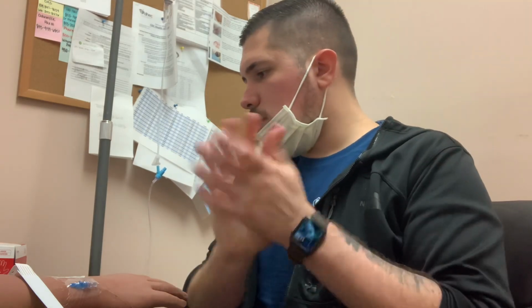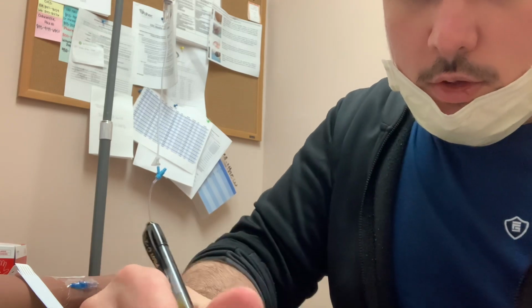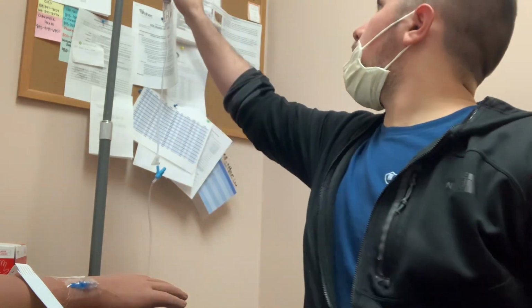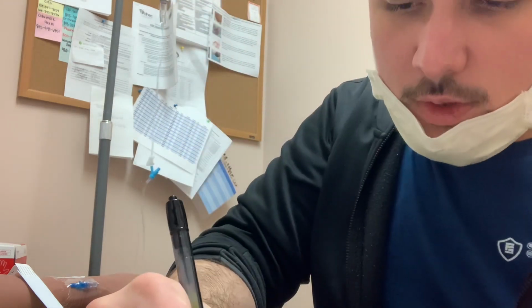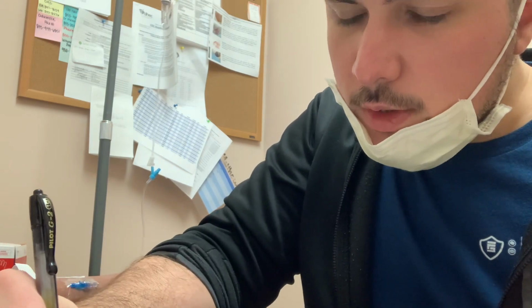So now we're going to doff our gloves, do hand sanitizer. We are going to fill out our MAR for the sodium chloride. So it was given. Let's start it at 1715. Flow rate is 125 mLs per hour.